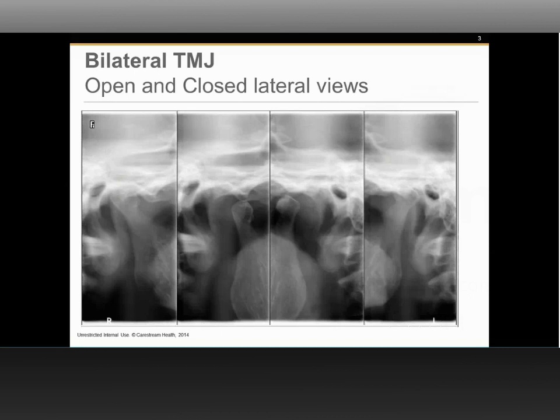Jordan, I think you just brought up a very good point. The reason 2D imaging is more prevalent among the dental community is simply because it is more available to the dental community as opposed to three-dimensional imaging. But that has changed. 3D imaging provides much more detail in terms of analyzing the anatomy of the TMJ. So there is a small shift, or a big shift, in fact, that's happening towards moving from two-dimensional to three-dimensional imaging of the TMJ.